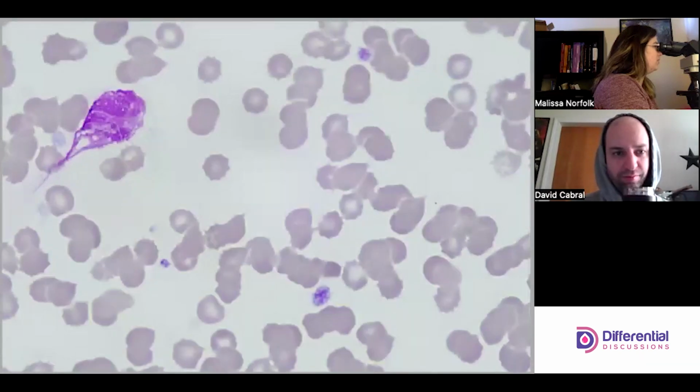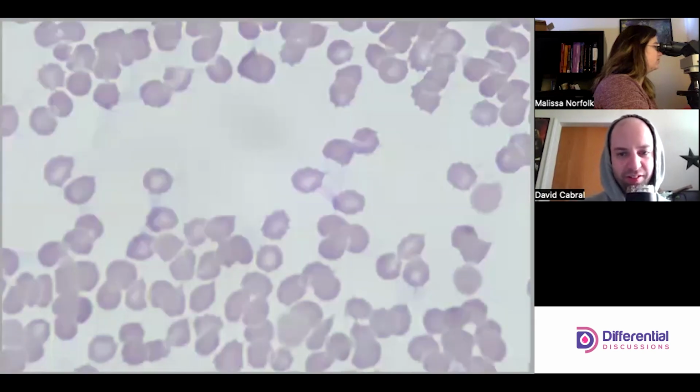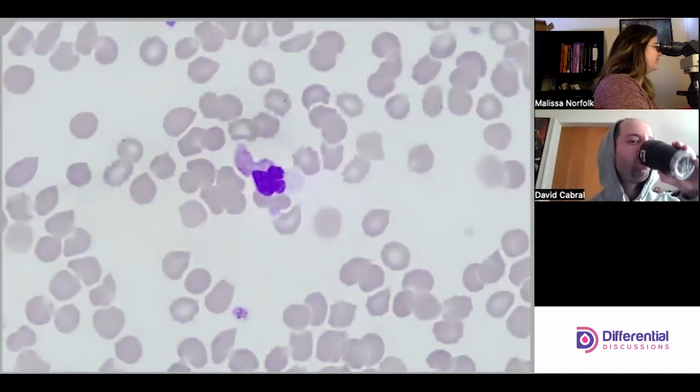Not going to get anything quite as beautiful as that one we just found. I think that was the grand finale.